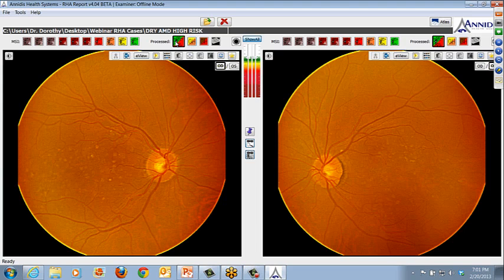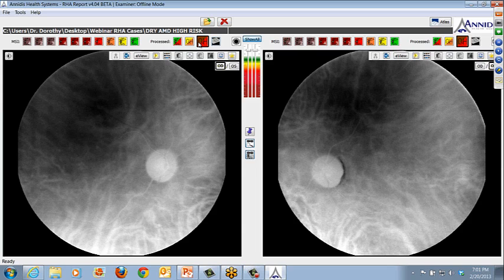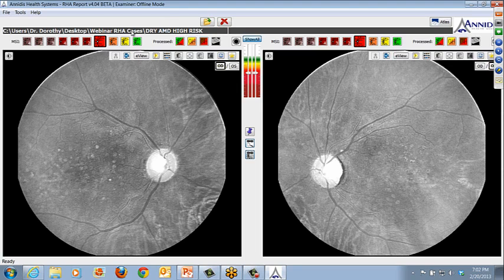Okay, but having said that, if you have OCT, honestly, this is a patient. If you have any metamorphopsia, you have even one single tiny little blot heme anywhere in that posterior pole near the macula, you should presume that there is a neovascular membrane until proven otherwise. And this is the type of patient you want to drive to your OCT. Okay, even a baseline is fine. But again, you can image these areas and you can image the large drusen, but you'll get good at looking at these images and determining that in fact there's no concerning PED or other exudative lesion there.